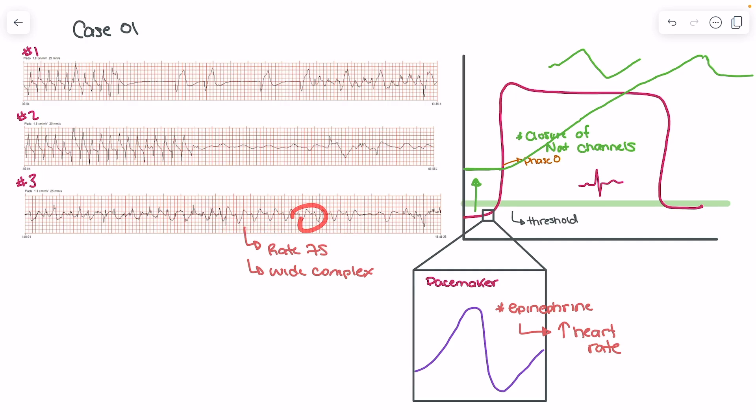So the rhythm is really wide, we had pretty clear evidence to support hyperkalemia based on patient presentation, as well as that sine wave rhythm on the ECG wide complex bradycardia. So we've got both clinical evidence and cardiogram evidence that would support hyperkalemia. And then following the epi, we start to see that speed up. So not uncommon that you might see that sine wave get faster in hyperkalemia, when we're giving epinephrine, which is going to stimulate the pacemaker to go faster.